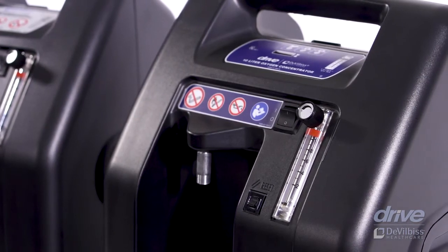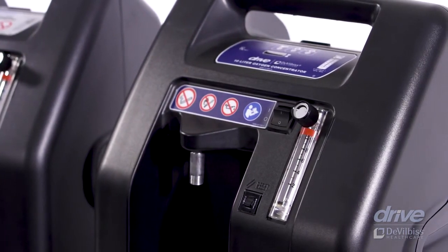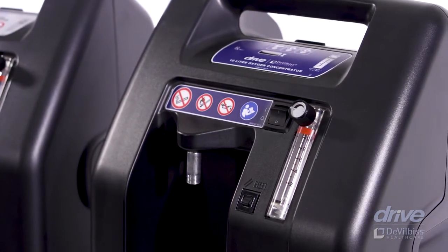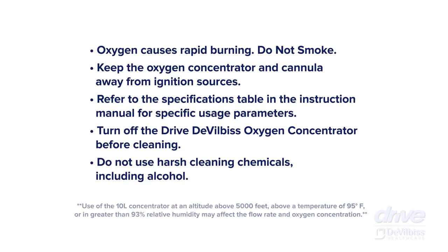When using this electrical product, always follow the basic safety instructions referenced in this video and in the instruction manual included with your unit. A quick reminder, oxygen causes rapid burning. Do not smoke while your oxygen concentrator is in operation or when you are near a person utilizing oxygen therapy. Keep the oxygen concentrator and cannula at least 6.5 feet from hot, sparking objects or naked sources of flame.